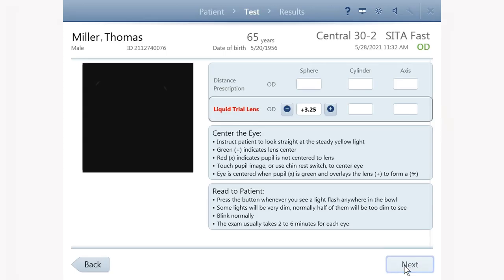If you are using the liquid trial lens, the instrument automatically sets the lens to the correct position for the patient's correction.